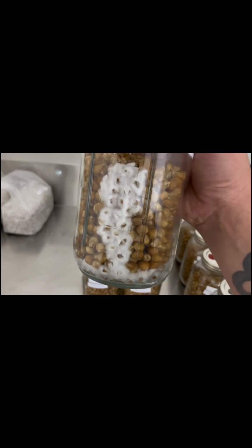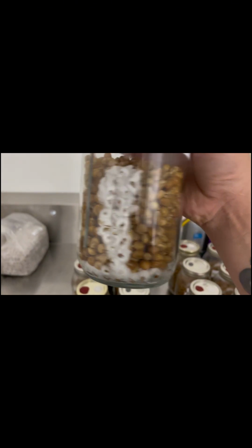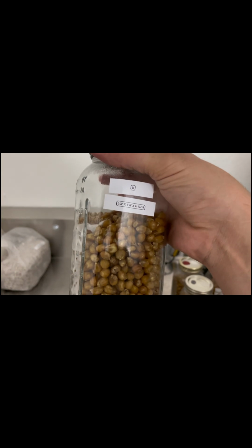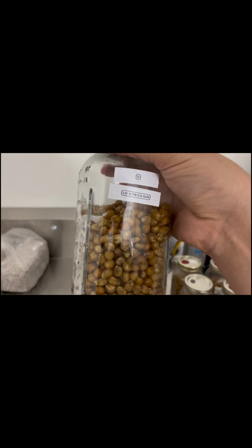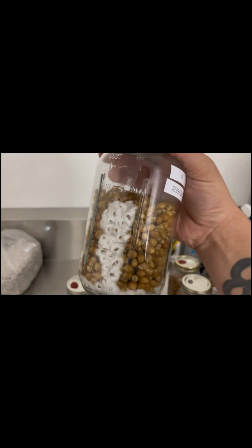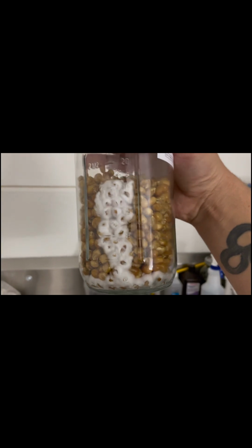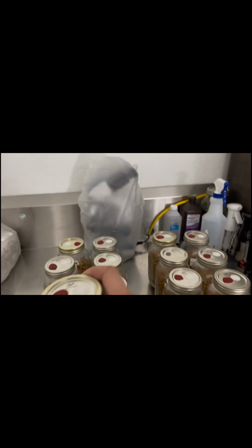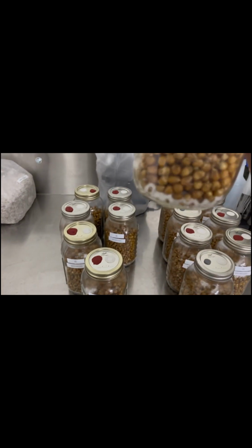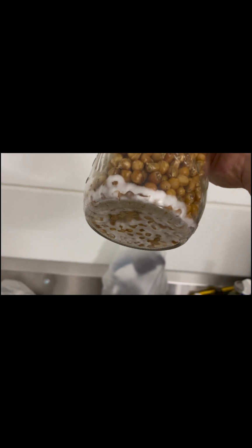But yeah, so here's the drippy. It looks like there's less in these jars just because the other ones are ball jars, and I don't know, these ones are a little wider or something. They look like less, but they actually all have 460 grams of corn in them. But anyway, there's that much growth in this one, which that one in the back where I sprayed it on the side looks pretty similar to this actually. But yeah, you can see this is the same thing. Sprayed it in the center, growth all over the bottom.